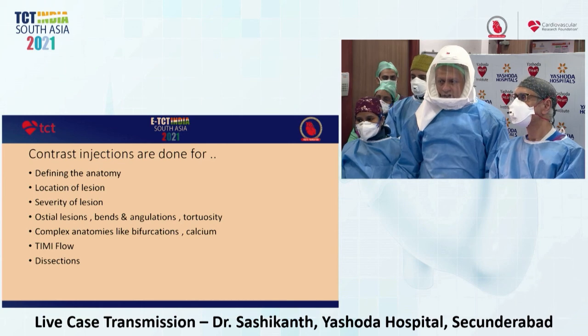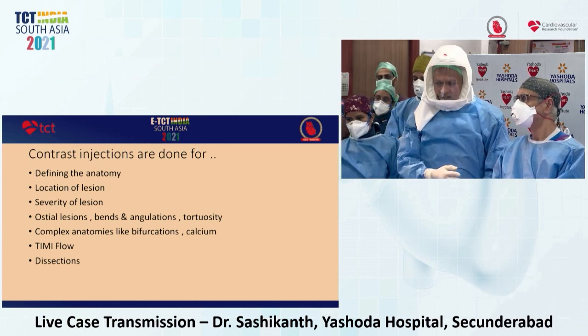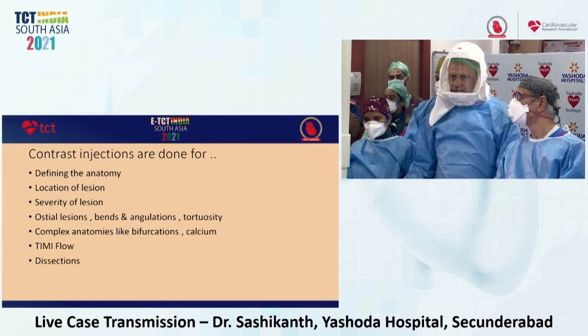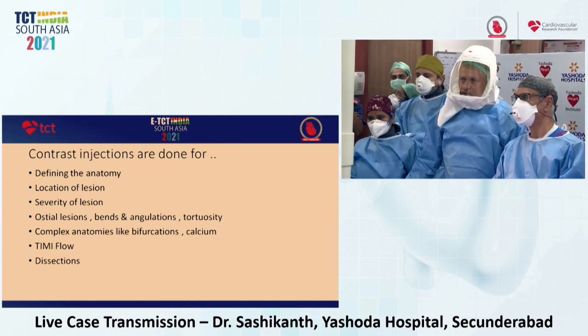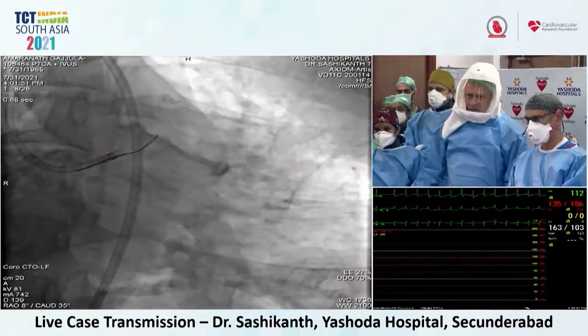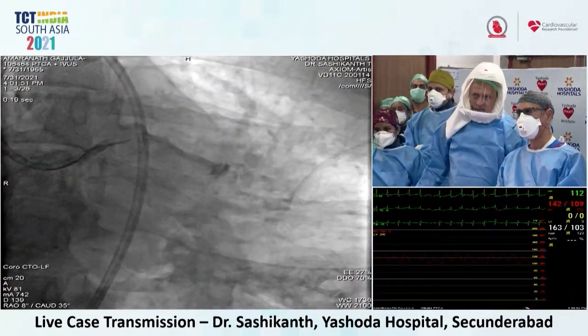Right. So what we have done so far, we've recorded a few images. Can we go to the first slide? Go to the first scene. So we had the previous angiogram playing on the screen. So we decided to go with the femoral route. And Dr. Rajasekhar, please go ahead.